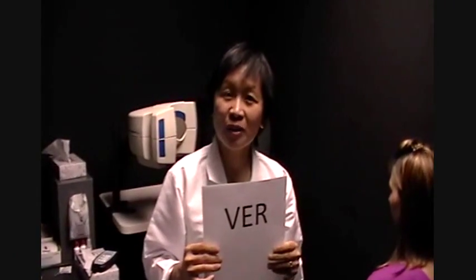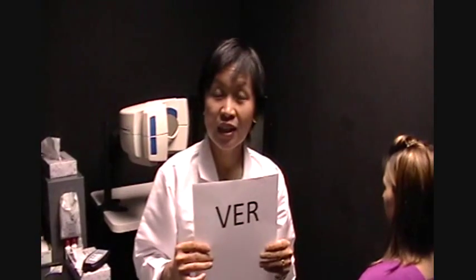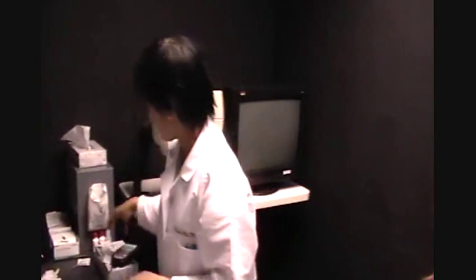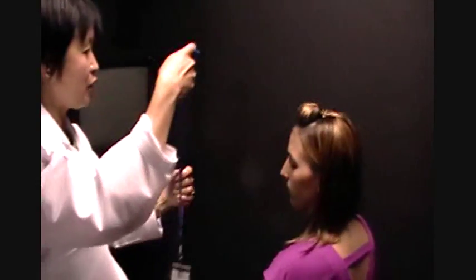Thank you for joining us. We're going to talk about VER and how to hook up a patient for this test. We're using the LKC technology equipment. Today we have with us Allison, and we're going to start with putting this amplifier around her neck.